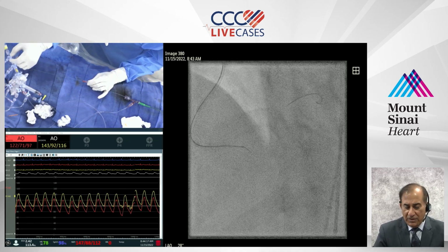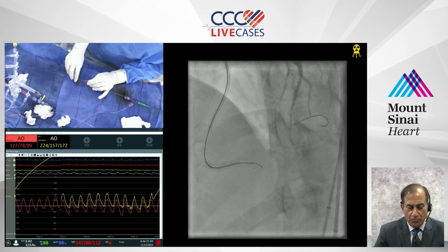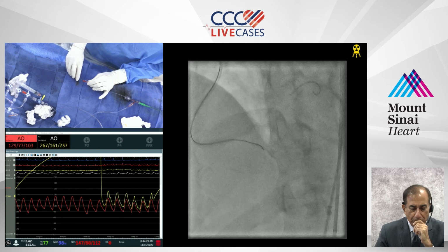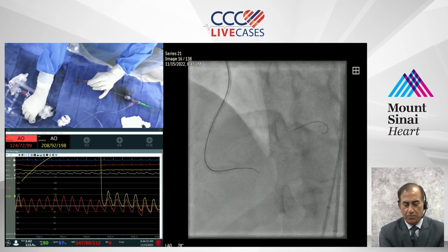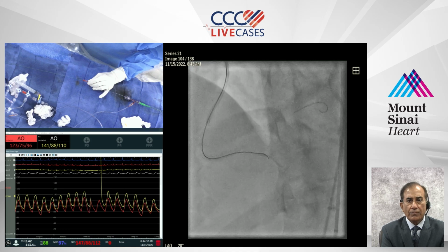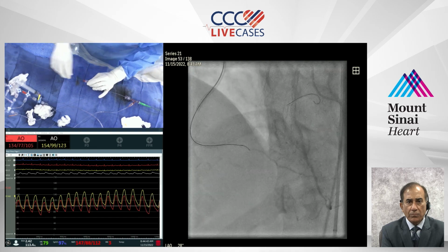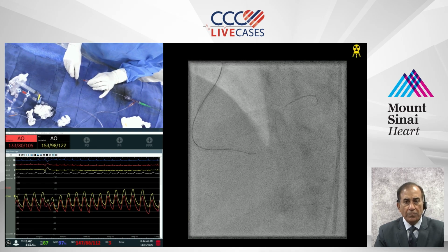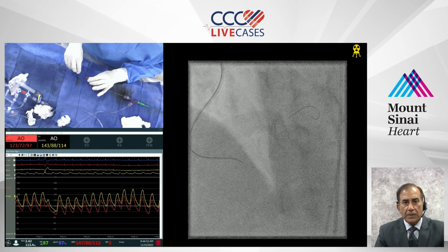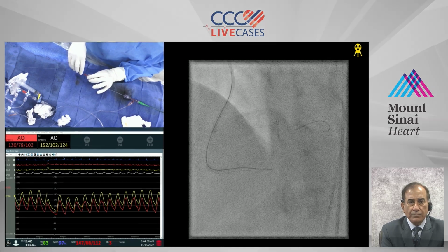Run through. Huh? Or Fielder. What do you want? Cine. You want cine, right? No, I didn't want that. We know we are there. Or you want to just go with the run through now? This is 300? No, regular run through. You can go. What do you need now? Yeah, I need another wire to exchange. Okay, which wire? 300 has to be. Another run through. Yeah, it looks like the wire is a little subintimal. No, it's going to a branch. You don't think so? Okay, we go with the run through now. You can throw it away.